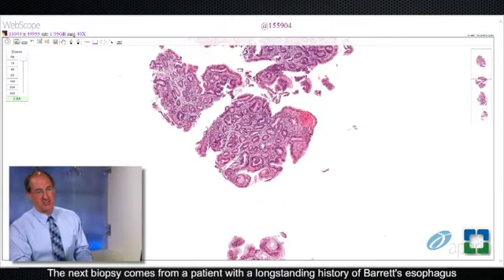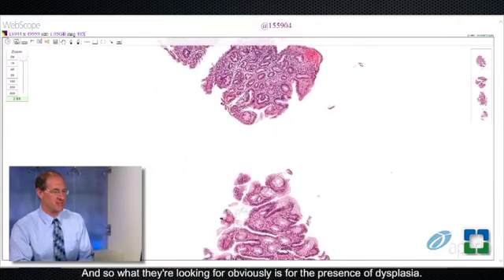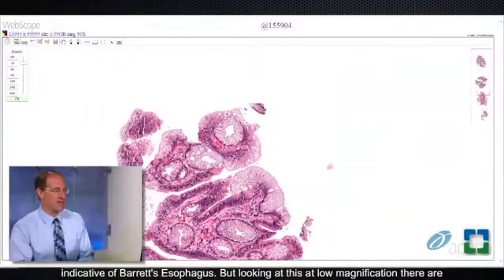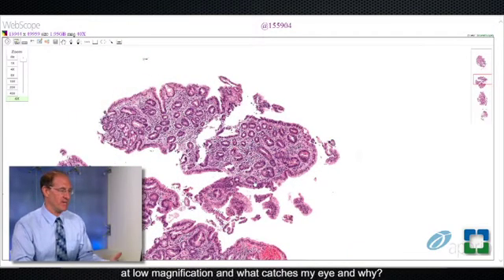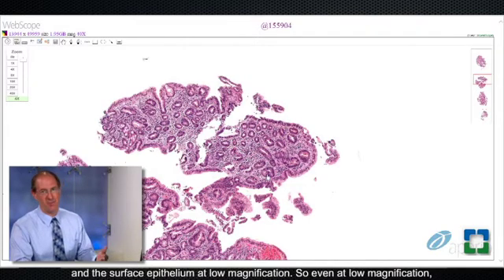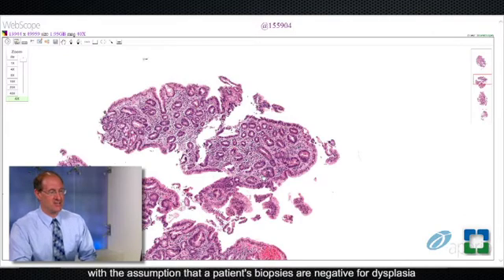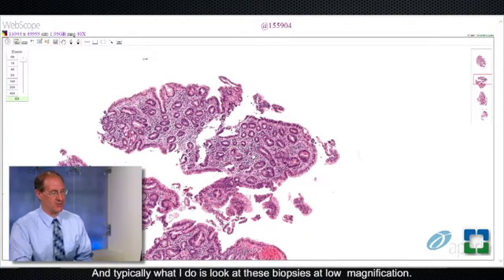The next biopsy comes from a patient with a long-standing history of Barrett's esophagus. Like most patients with Barrett's, these patients undergo periodic endoscopic surveillance and biopsy looking for the presence of dysplasia. Looking at this at low magnification, you can see some goblet cells indicative of Barrett's esophagus. There are some areas that really catch my eye — this piece right here catches my eye because of the hyperchromasia of the glands and the surface epithelium at low magnification. I'm suspicious there is some dysplasia. Keep in mind that most patients with Barrett's have biopsies that are negative for dysplasia — I always start with that assumption and say you have to prove to me that dysplasia is present.